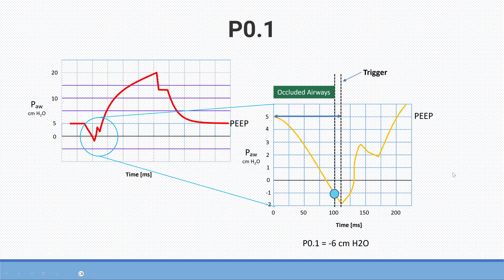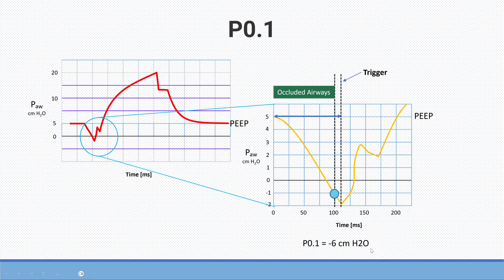This is of great value because during that initial drop, the airways are occluded and then the pressure is measured in the first 100 ms. As you can see in this case, the pressure dropped from 5 to minus 1, so that is minus 6 cmH2O. This represents the initial pressure drop generated by the patient's own effort.